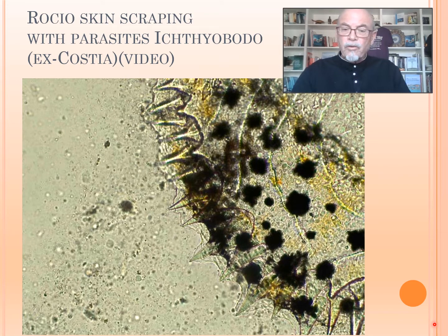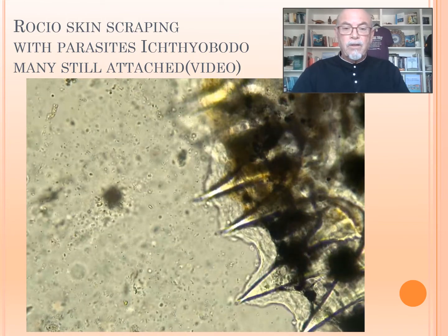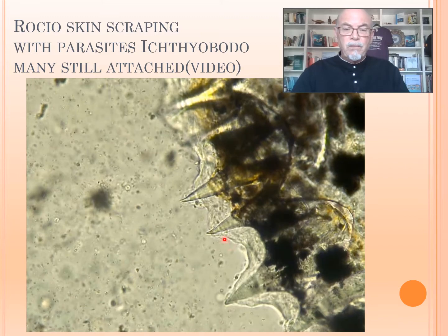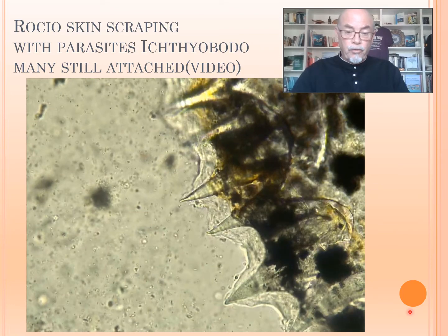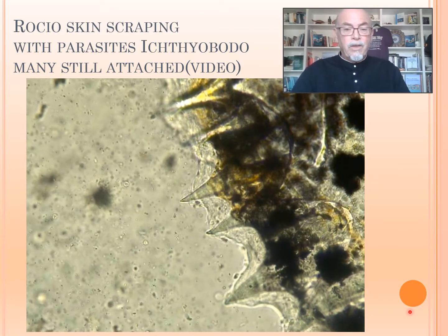It's not so easy to see at this magnification of 100, so let's go to 200, 300, and then we see here all those tiny flagellates. See them here, sitting here attached? They're not swimming around that many, but there are many attached, so they're for sure causing a serious problem for the fish. Skin lesions and bacterial infections can occur.